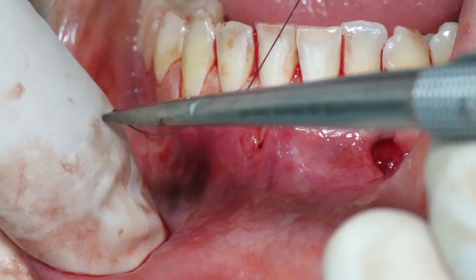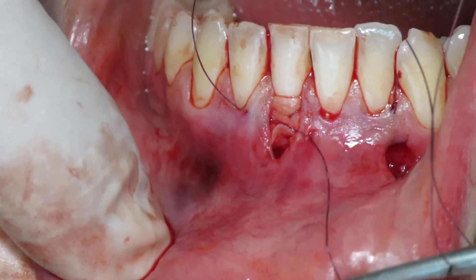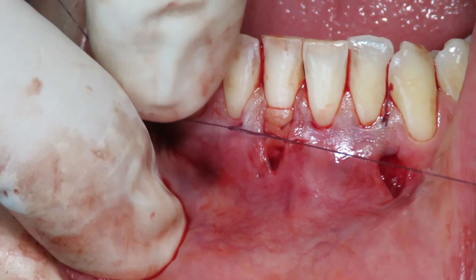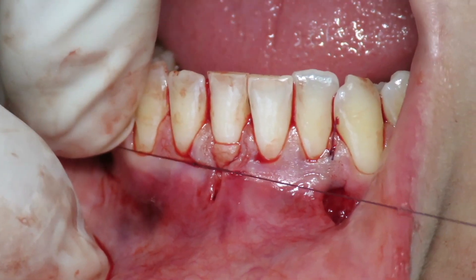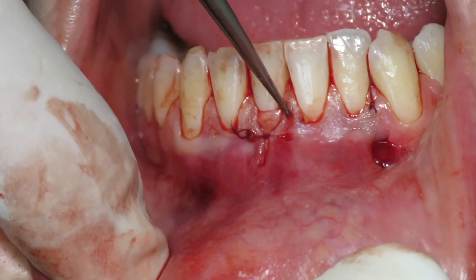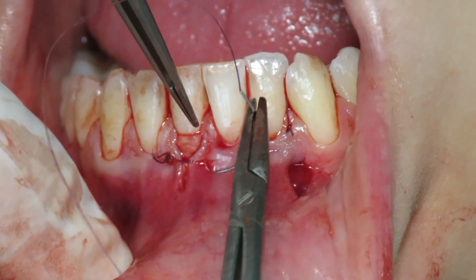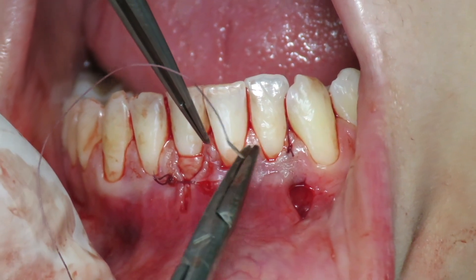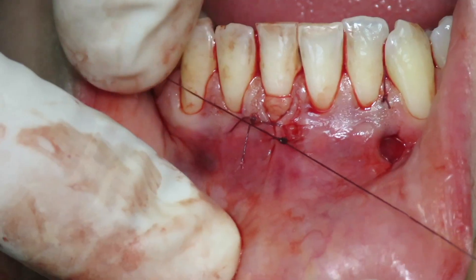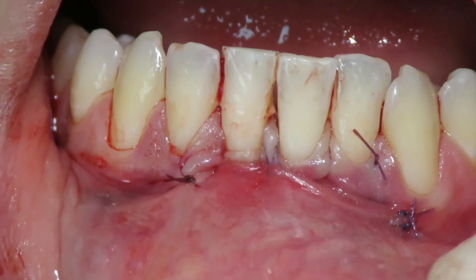However, in this case the tissues were very friable and extremely thin. So we had to advance some part of the vestibule to be able to cover the excessive connective tissue. We performed a full sling suture to advance the vestibule and cover the recession, as you can see here.